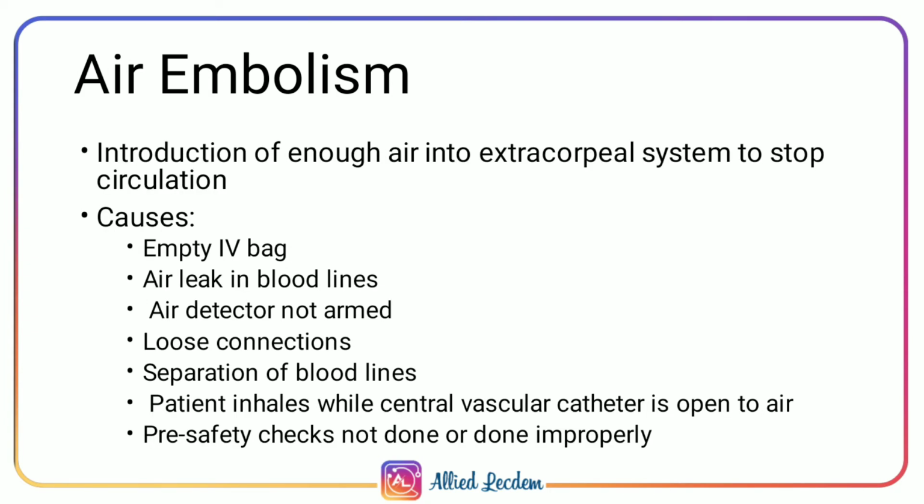Air embolism. Introduction of enough air into the extracorporeal system to stop circulation. The causes for air embolism are empty IV bag, air leak in bloodlines, air detector not armed, loose connections, separation of bloodlines, patient inhales while central vascular catheters are open to air, and pre-safety checks not done or done improperly.